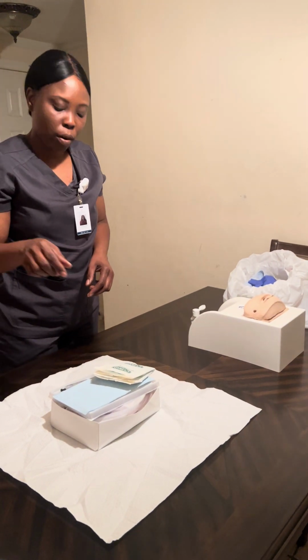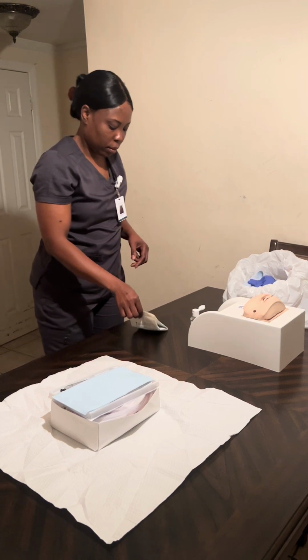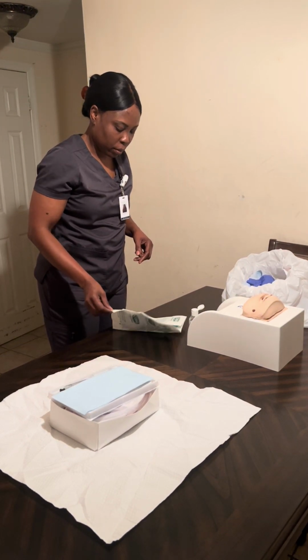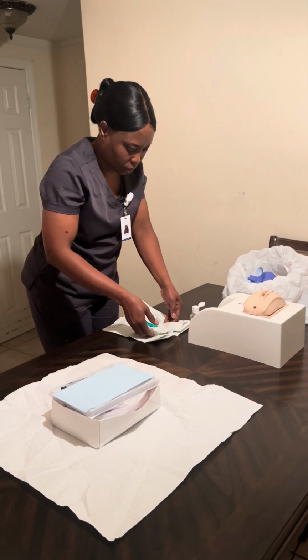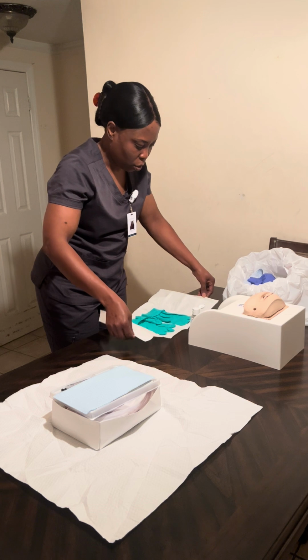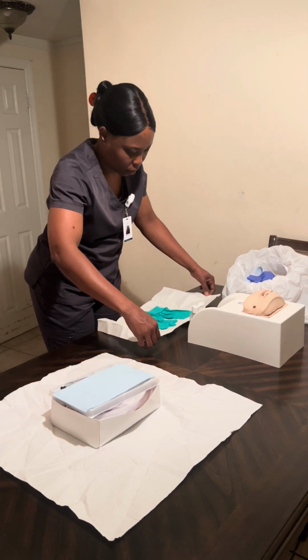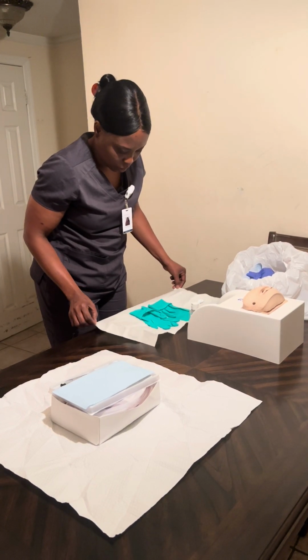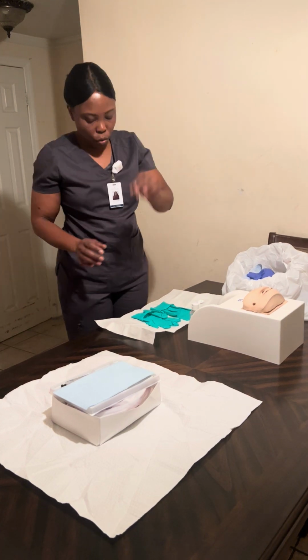Now I'm gonna take my gloves out. I'm gonna use 2 fingers. I'm gonna open my gloves. I'm gonna make sure not to touch it inside. I'm gonna use 2 fingers.